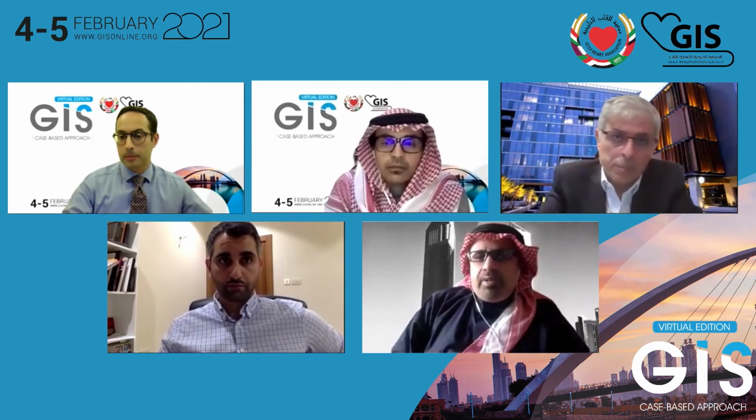I think great job. Hatim, you still can do intravascular imaging. You said you're bringing her back for staged RCA PCI. And at that time, a lot of people are now talking about staged optimization of these vessels because negative remodeling may improve over time. You're bringing this patient back anyway, you can IVUS the left main and proximal LAD and optimize that stent as a staged procedure pretty well.